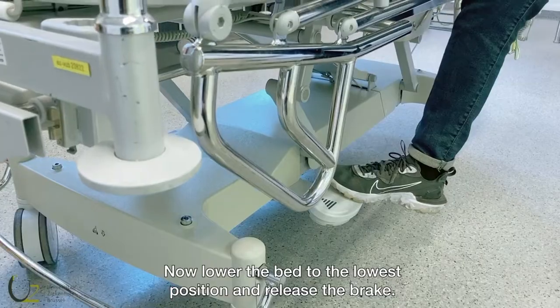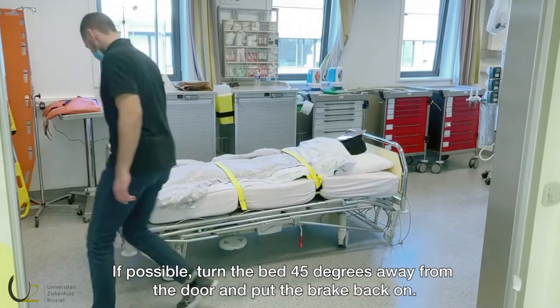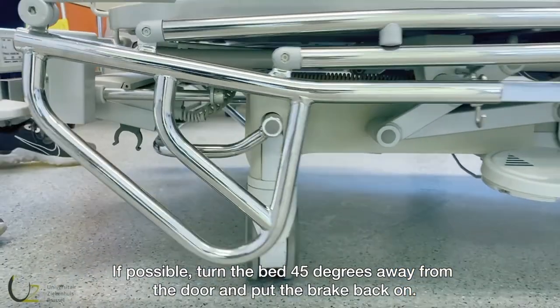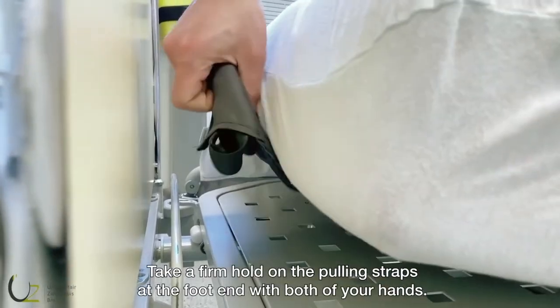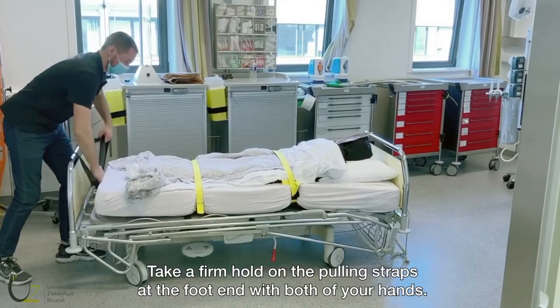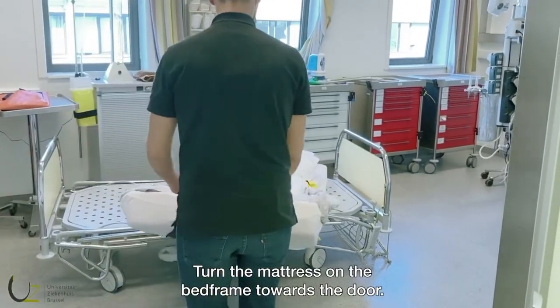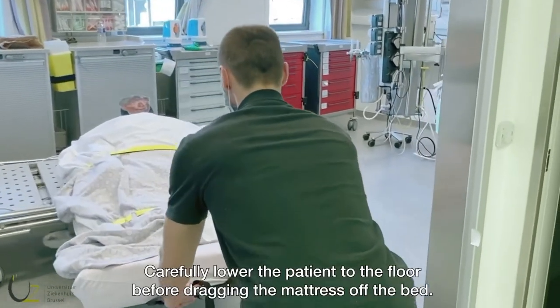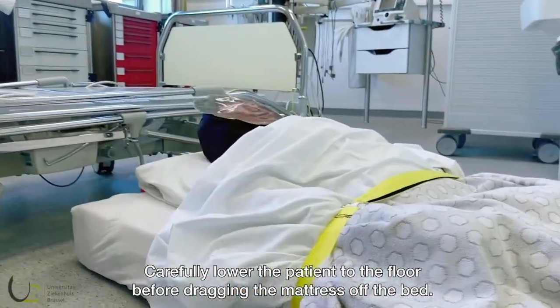Now lower the bed to the lowest position and release the brake. If possible, turn the bed 45 degrees away from the door and put the brake back on. Take a firm hold on the pulling straps at the foot end with both of your hands. Turn the mattress on the bed frame towards the door. Carefully lower the patient to the floor before dragging the mattress off the bed.